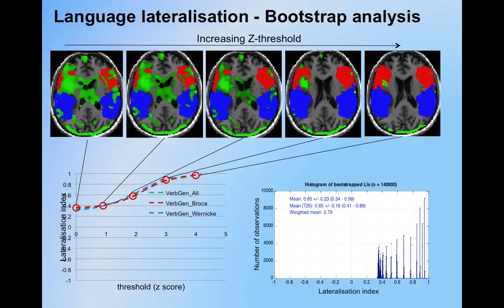Okay, and then we do this again, and we do it about 10,000, 20,000 times, and that allows us to build up some statistics of how sure we are of our lateralisation index. So these are represented by these little sharp spikes we've got here, which are actually histograms, representing the number of times we've measured a particular lateralisation index when I've repeated this, say, 10,000 times. So the upshot is that the sharper this point is, the more faith we have in the lateralisation.